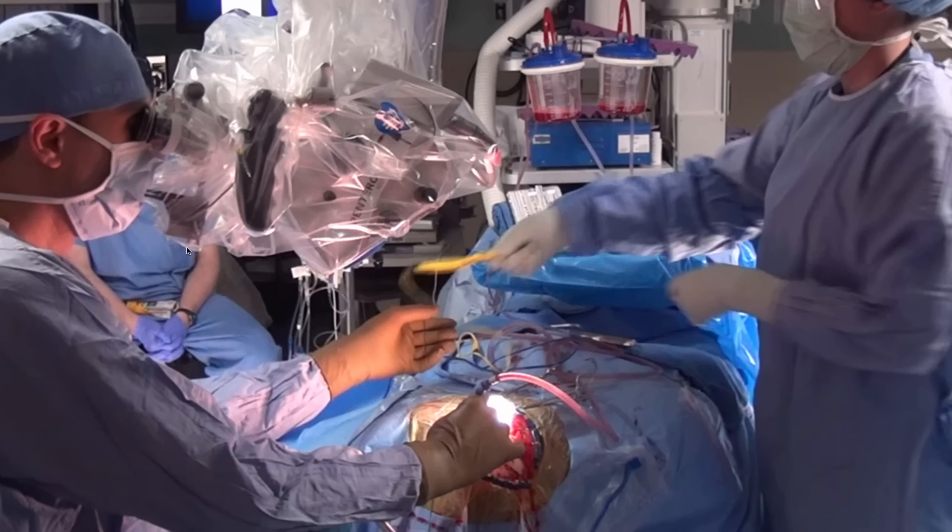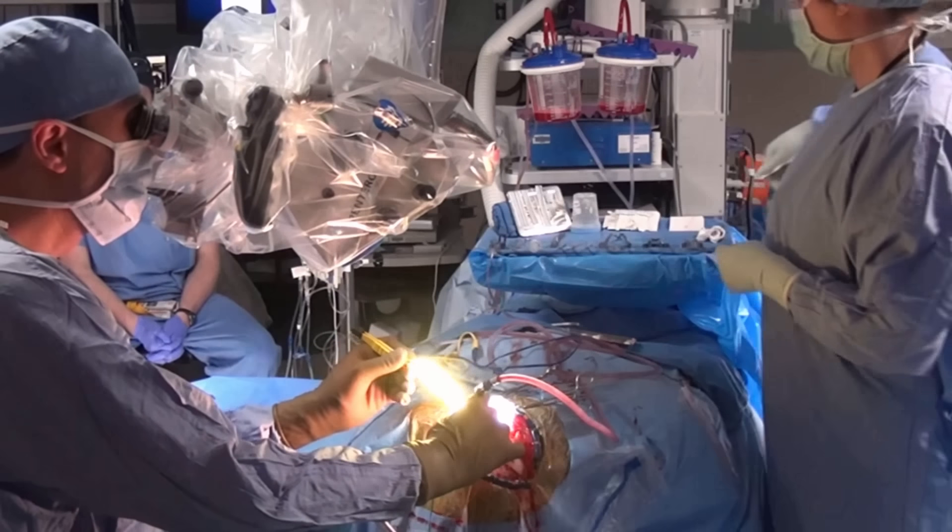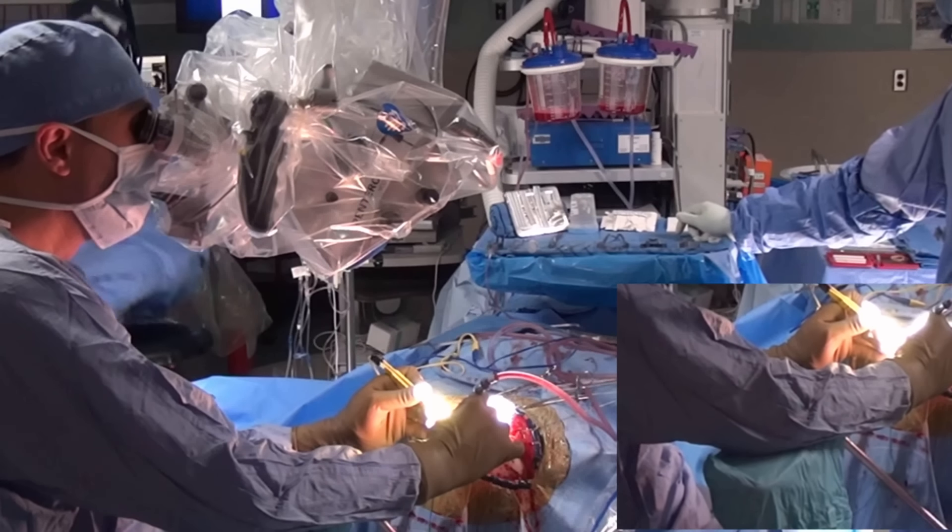The mouthpiece is an important part of improving surgical efficiency, as the operator requires a minimal amount of time to adjust the height of the microscope and keep the image in focus. You can see the use of the mouthpiece here.